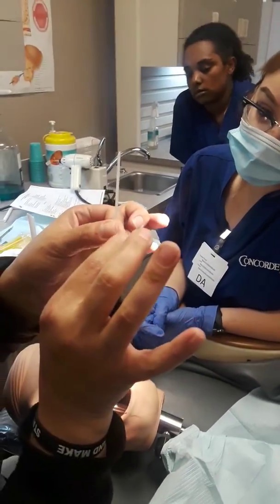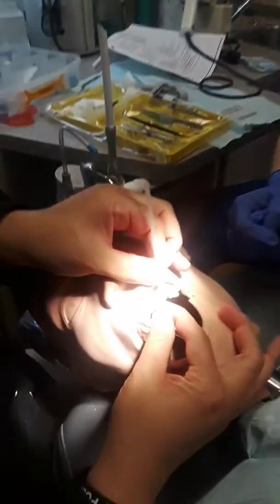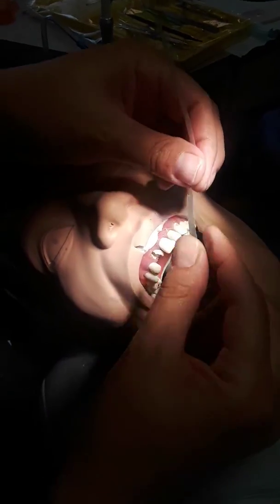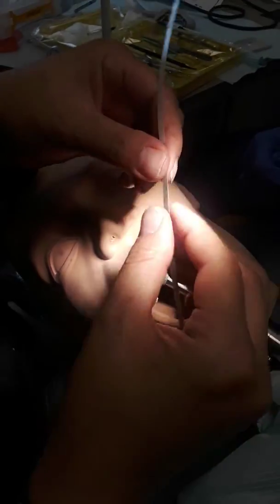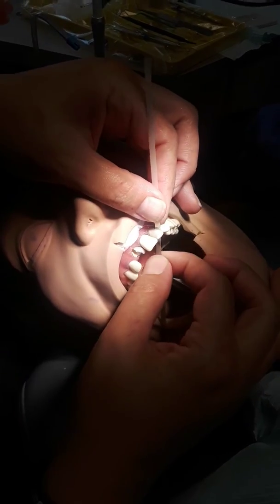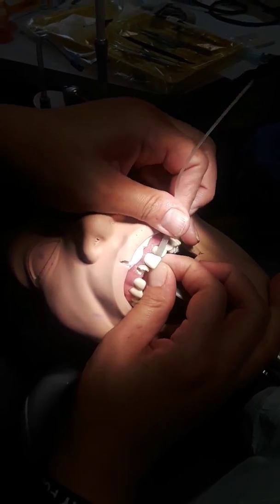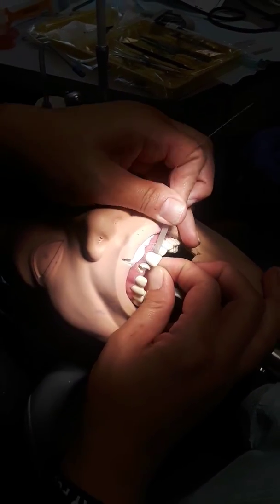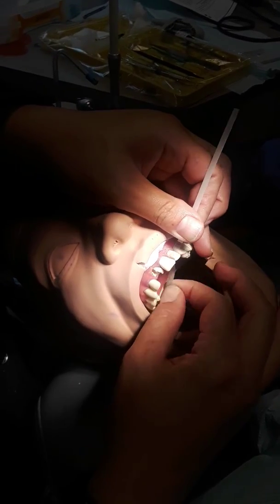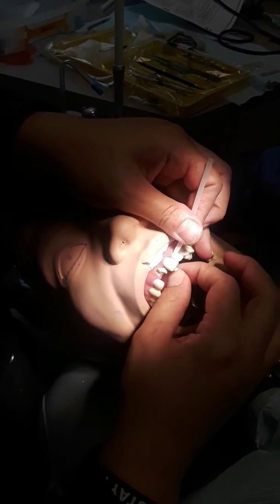The finishing strip has two different colors: coarse on one end, polishing on the other. The clear section goes between the teeth. Put it in at the clear section, then do the coarse side first — make sure the coarse side is facing where you need to cut. You can hear it grind. Pull all the way through, then polish.